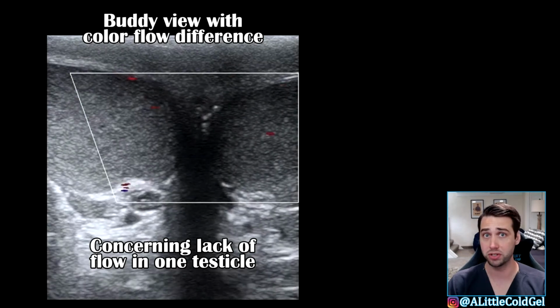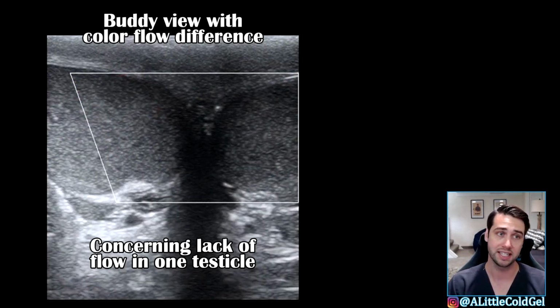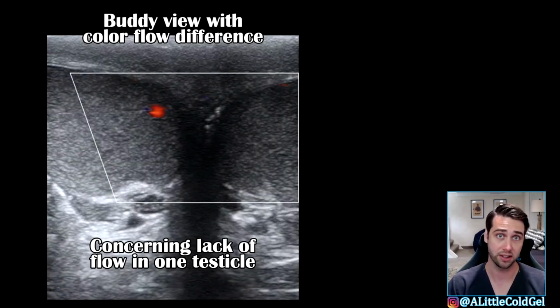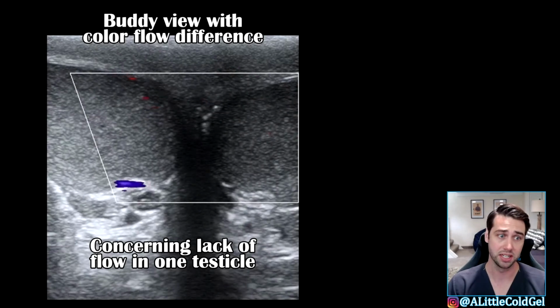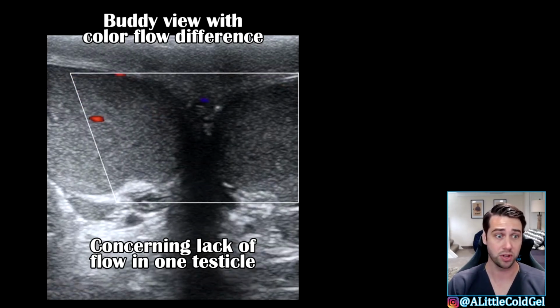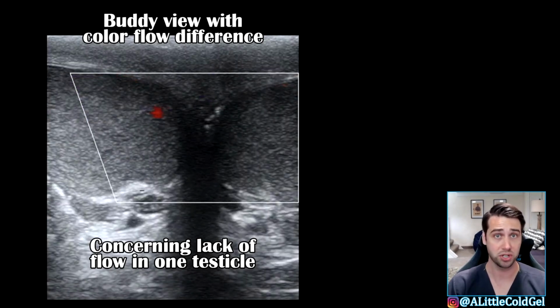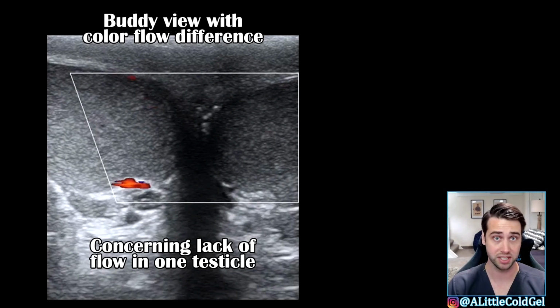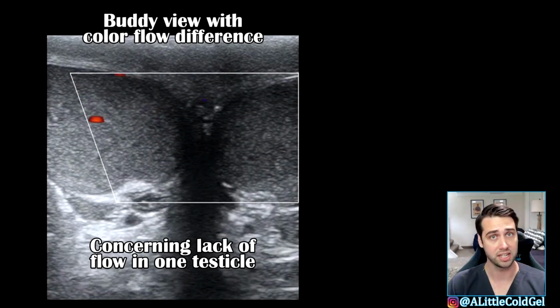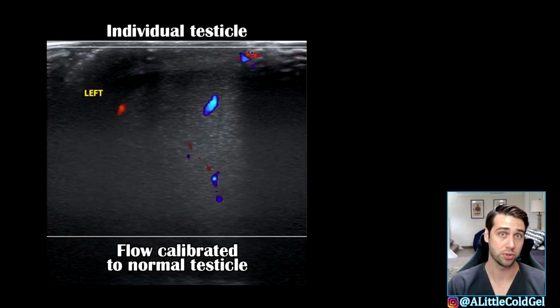Now next, while you're in the buddy view, I like to put a color flow box over both testicles at the same time. And that's for the same exact reason. You want to compare one side to the other, and this is an easy view to do it in. So here we can see that the right testicle in this image has a good amount of flow, while there's a concerning lack of flow in the left testicle. So this should really key you in, especially if the left testicle is the testicle of complaint. Hey, there could be something going on here that looks like it has to do with blood flow, i.e. torsion.